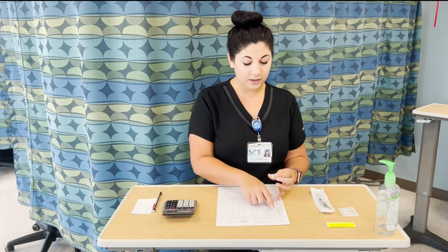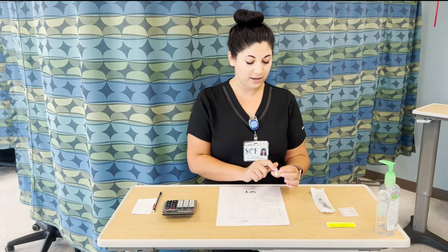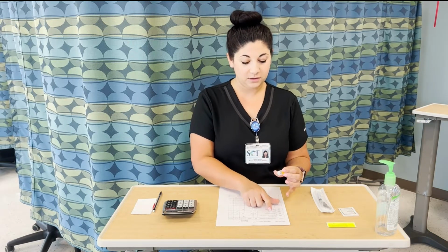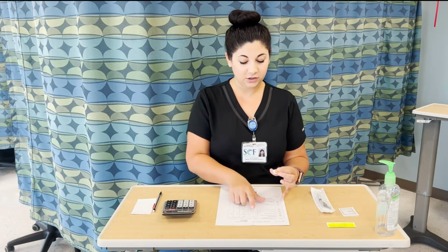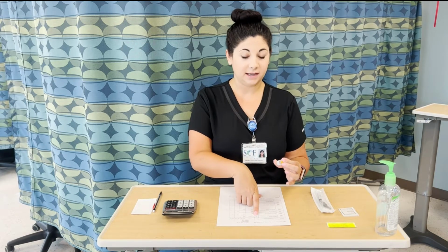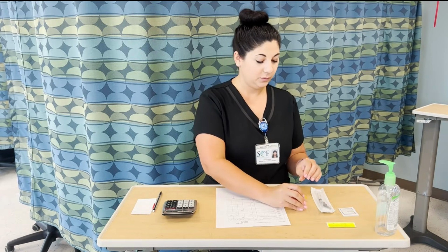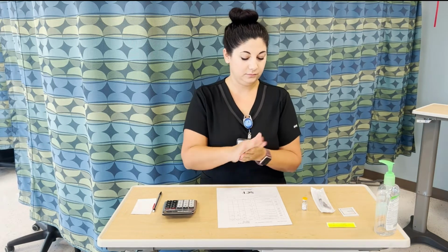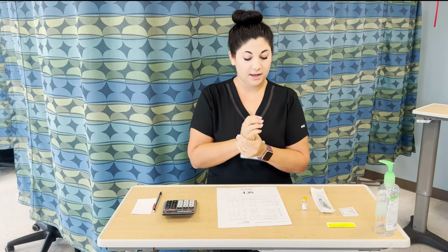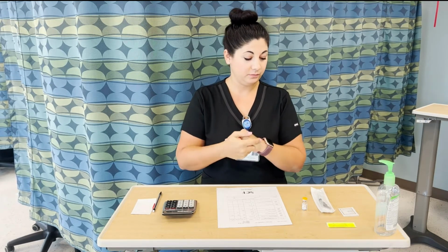I am comparing the name of the medication, stating that out loud, on the MAR and on my medication. I'm checking the dose on the MAR and the dose on the medication and ensuring my route says IM and it is the correct frequency. I'm going to wash my hands. I have calculated my dose and I know that I need 0.5 milliliters of this medication.